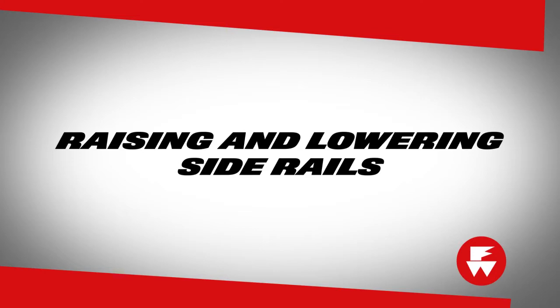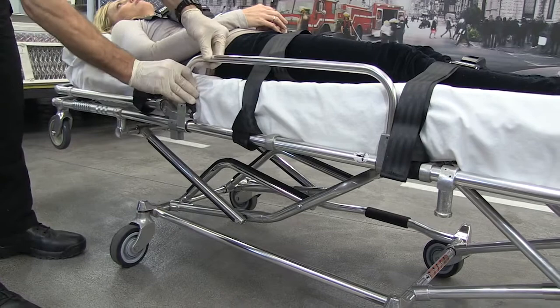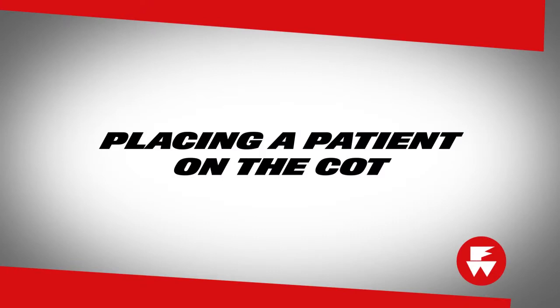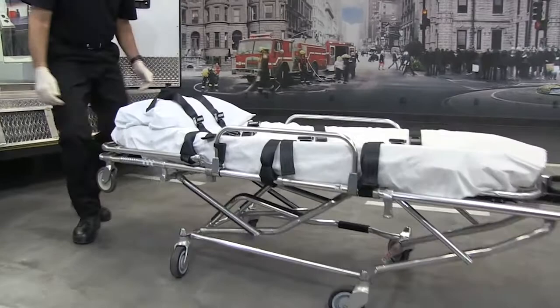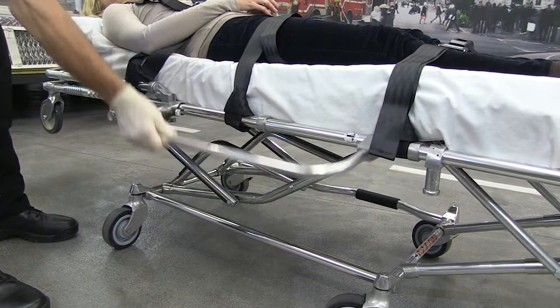Keep the side rails up except during patient transfer. Lower the side rails when transferring the patient to or from the cot. To do this, pull the lock pin or squeeze the quick release and lower the rail. To raise the side rail, simply lift the rail until it locks. To place a patient on the cot, first adjust the cot to the appropriate height, then lower the side rails and transfer the patient to the mattress using accepted medical procedures. Raise the side rail and secure all the restraints.